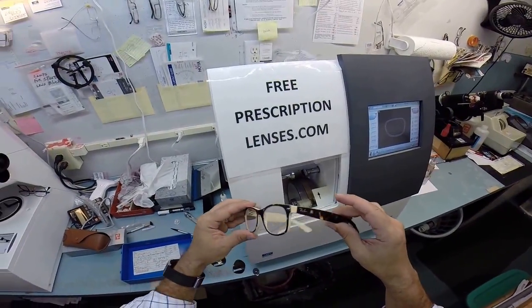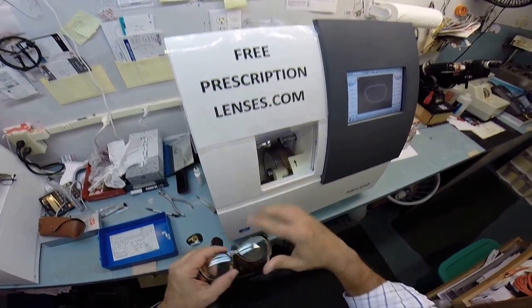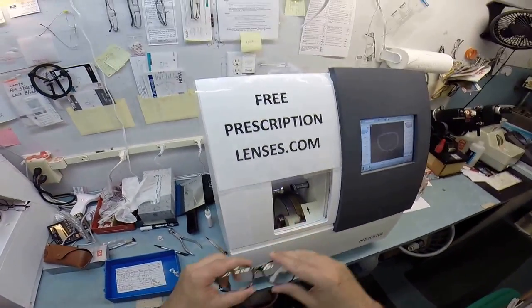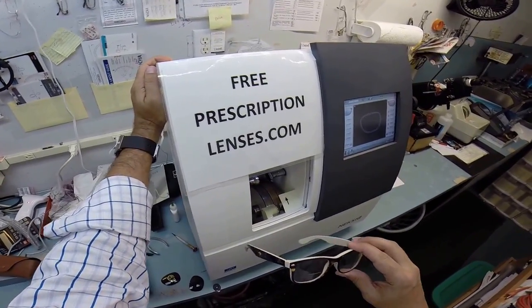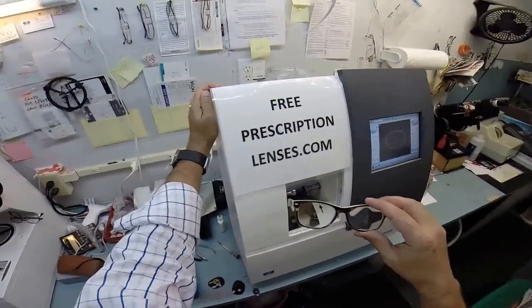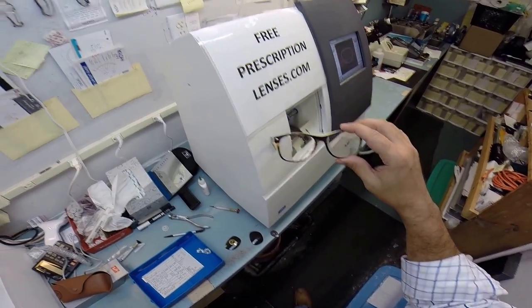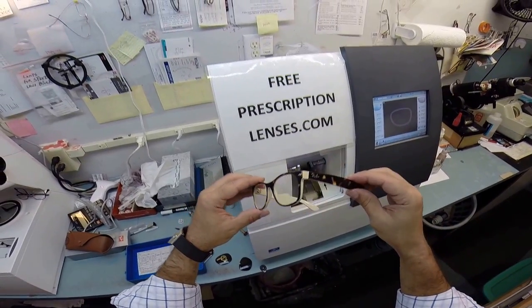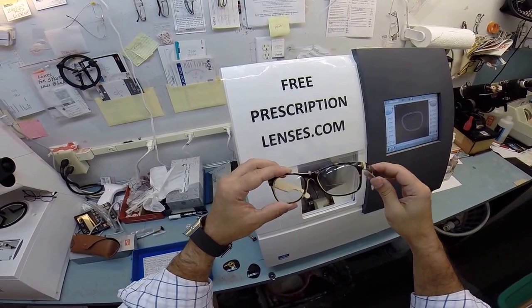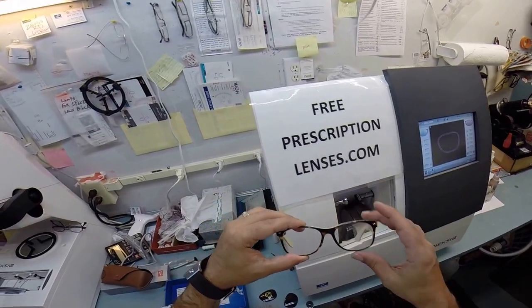If anyone has any questions about what I can or can't do, which there's nothing I can't do with a pair of glasses and a prescription, once I learn the new equipment, that is. But just email me if you do have any questions at freeprescriptionlenses at gmail.com. Caroline, I thank you from Carolina, but Caroline in Lafayette, Louisiana. I hope you enjoyed watching as I made your prescription Ray-Ban bifocals clear. Your next pair that you contact me about will have your sunglass lenses in it.